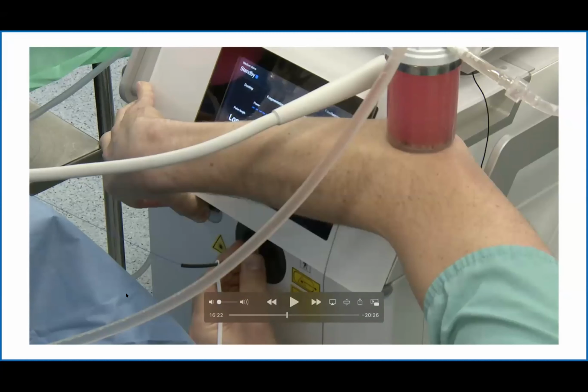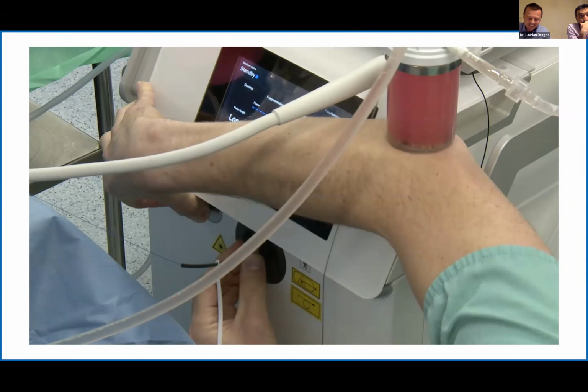Yeah. So Kay Thomas has just made the point that the big change that we've got now over the last few years with percutaneous surgery is that we can really tailor and flex our approach. We've got supine, we've got prone, we've got mini, we've got ultra mini, we've got standard PCNL. So there's really a lot of careful choices that we can make to adapt to the situation for the patient and the stone, which is completely right. Yeah, it's amazing and fascinating, isn't it? And if we can have all these tools, it's so good to be able to adapt to the needs of the patient.